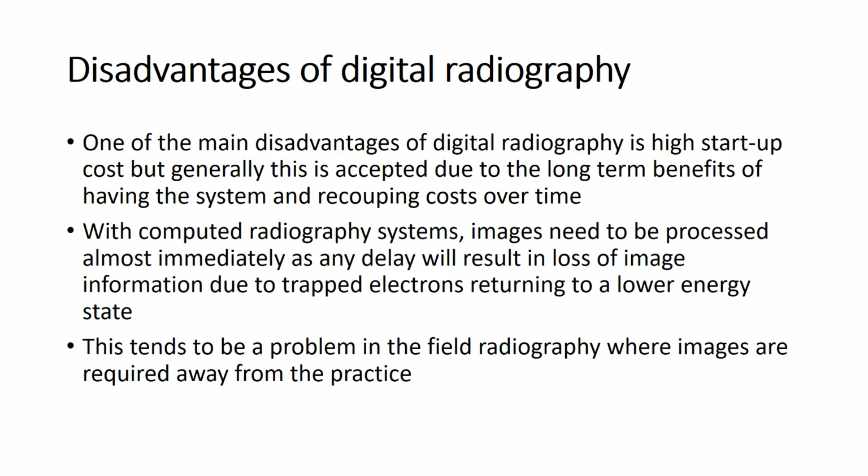After advantages, certain disadvantages are also there. So, let us discuss the disadvantages of digital radiography. One of the main disadvantages of digital radiography is the high startup cost, as I have already told you, but generally this is accepted due to the long term benefit of the system and recouping the cost over time.